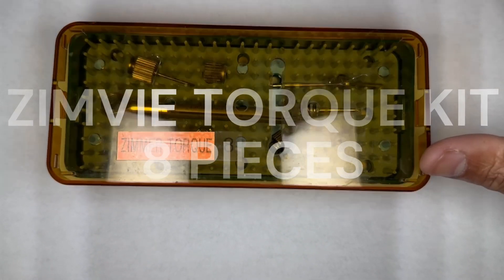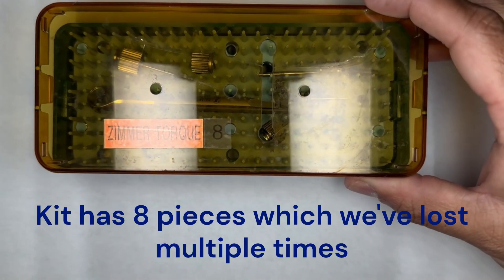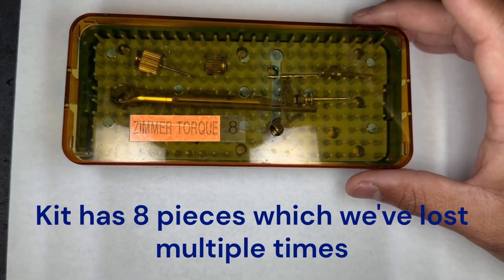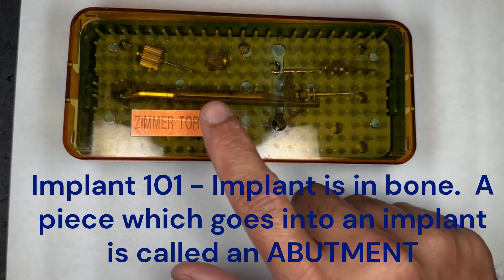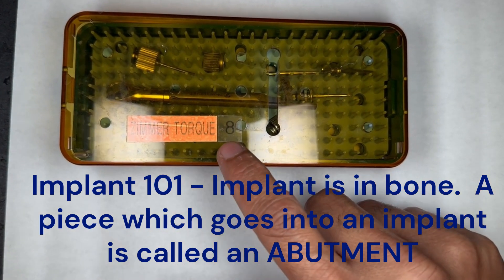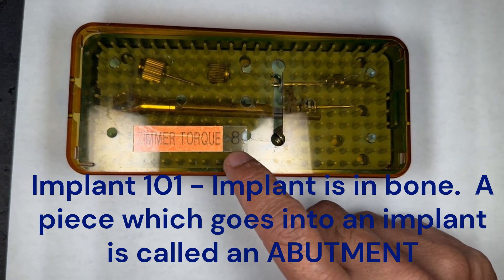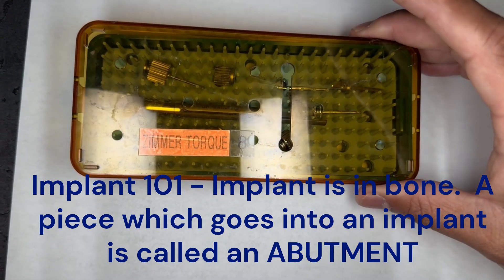Here's our Zimmer torque wrench cassette. I wanted to go through it specifically because this one seems to have issues with us losing pieces for it. This is for Zimvee. There's a small label here which says there are eight pieces in here, and that's our way of confirming we have all eight pieces.